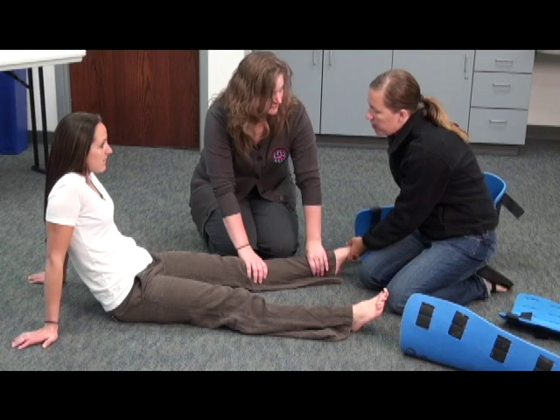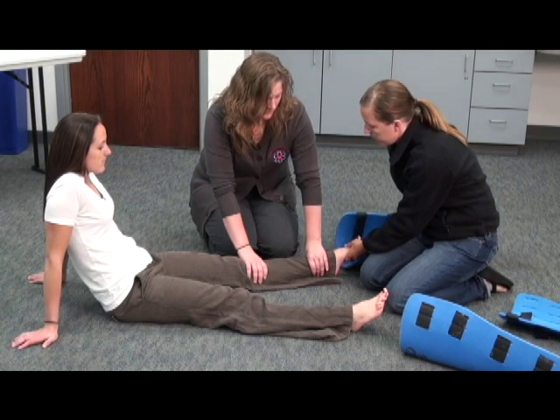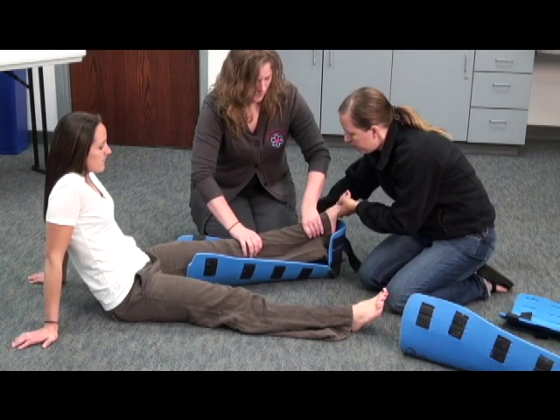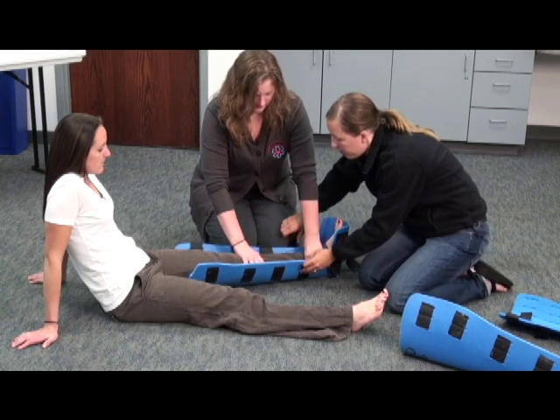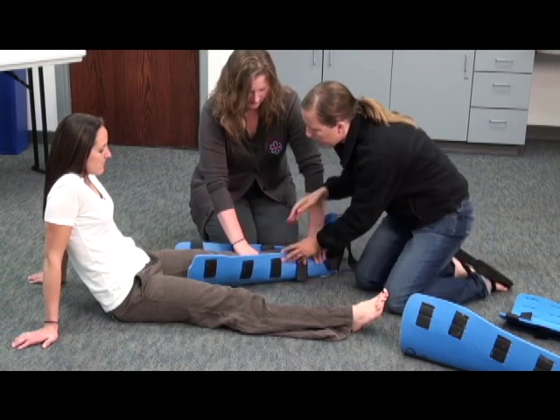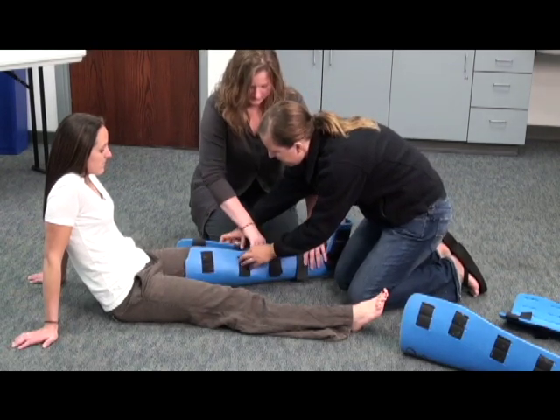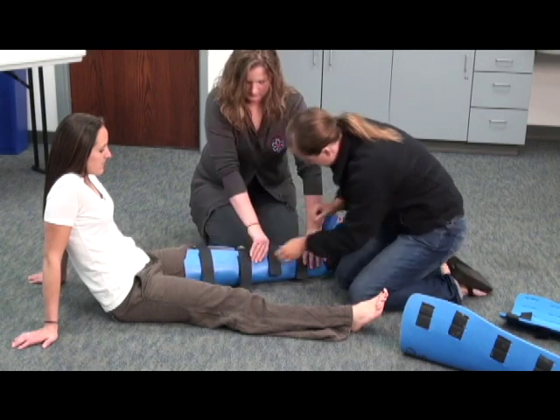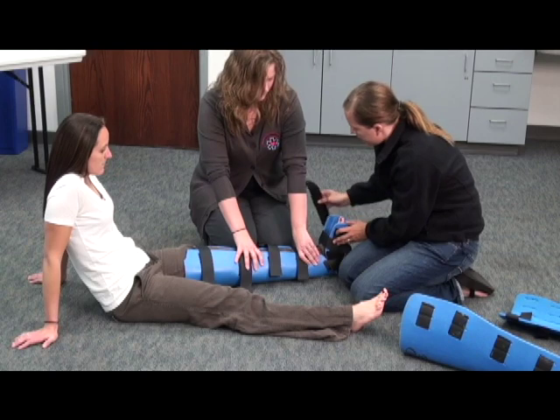On the count of three, we're going to lift up. I'm going to slide the splint underneath, and you can count. One, two, three. And on the count of three, pull down. One, two, three. At this point, I'm going to secure the splint, making sure not to secure right above the injury. And her foot is in the position of function.